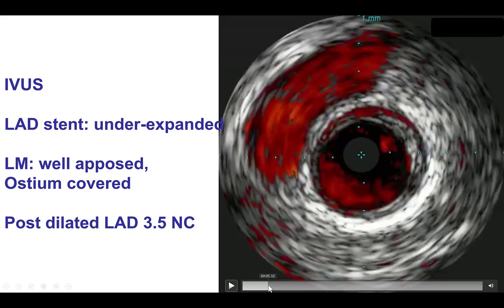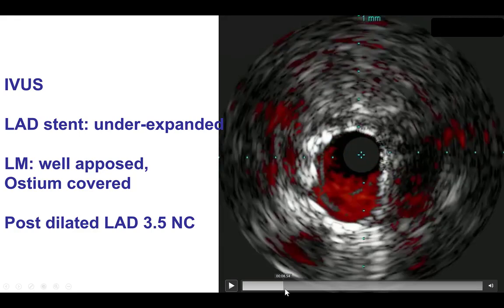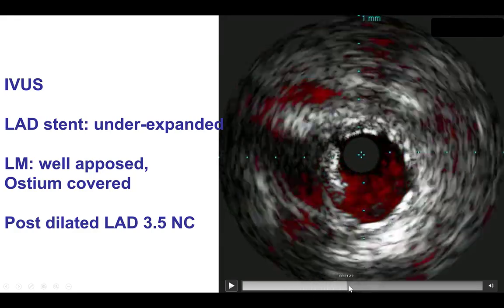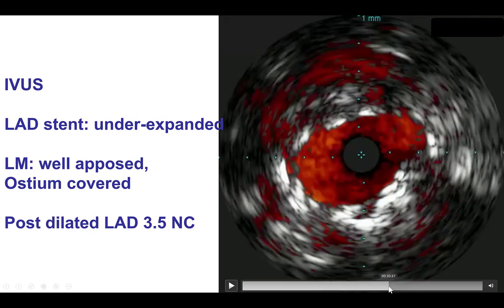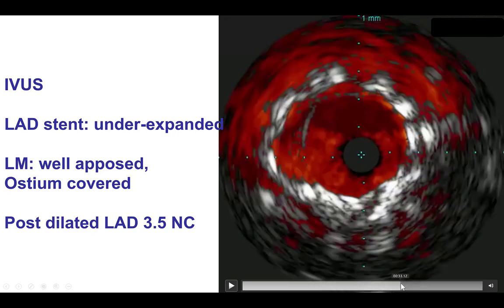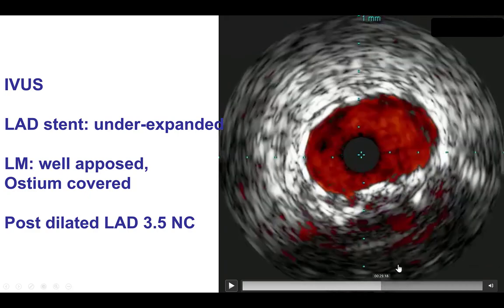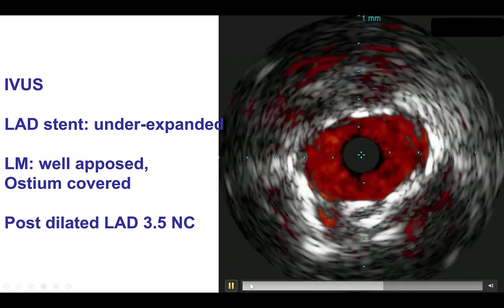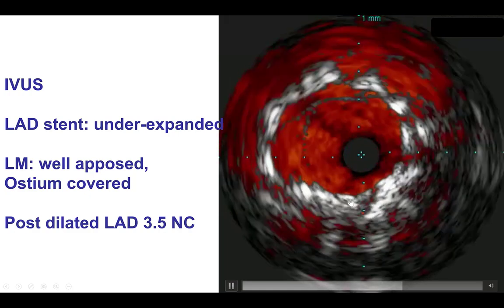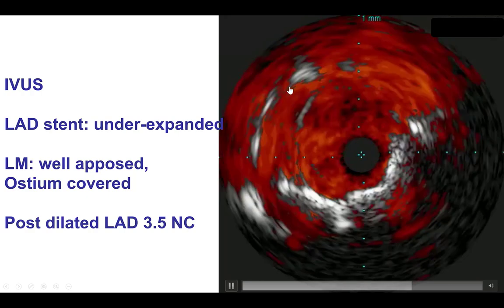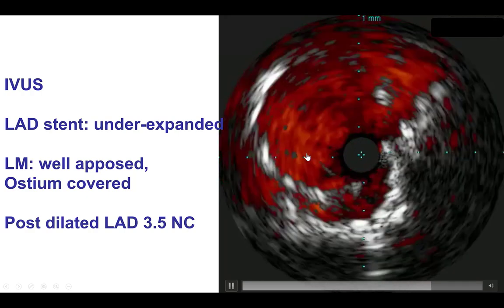What we found is that there was some disease distally. The LAD stent was not well expanded, so we needed more aggressive post-dilation. Here is the left main — that actually seems to be expanded okay, although it does have an oval shape. We found that the stent was nicely protruding into the aorta, so we had clearly adequately covered the ostium of the left main.